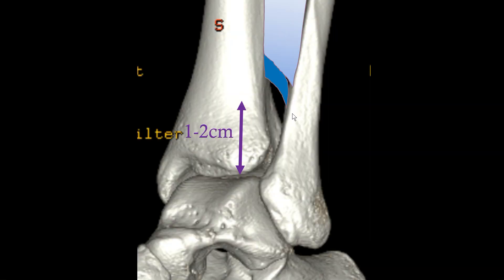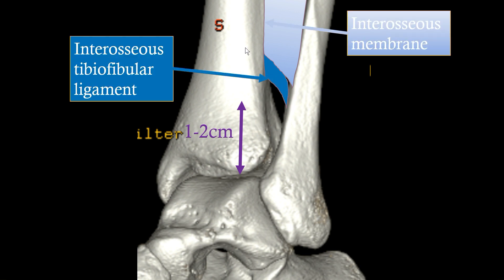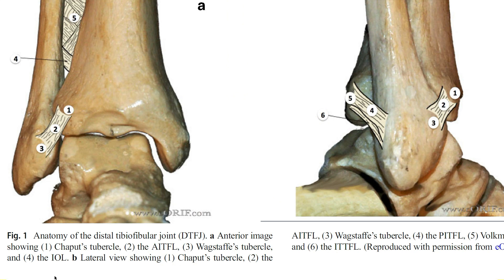The third component is the interosseous tibiofibular ligament, running from the tibia to the fibula in an oblique orientation from proximal to distal, and everything above it is the interosseous membrane. Keep in mind that in some references the orientation of this ligament is described the other way around — I think that is a mistake. In one of the most recent publications in skeletal radiology the orientation shown is basically wrong, and I will show you in a real patient how the orientation should look.